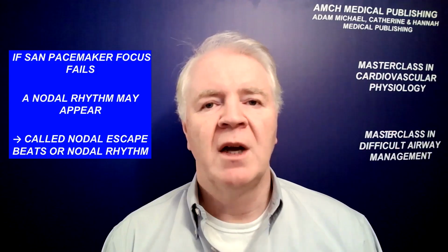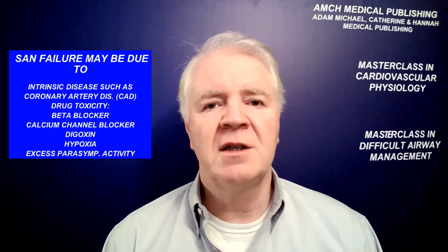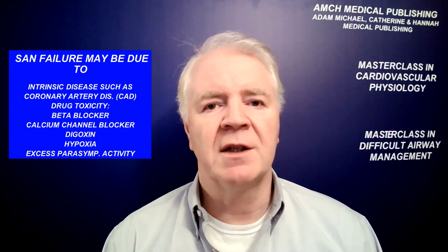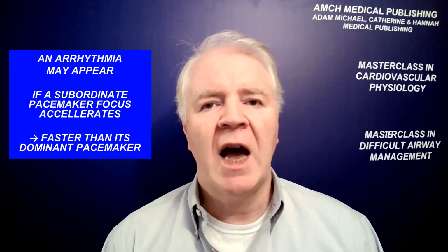This is nodal rhythm, and the causes of nodal rhythms are those of sinoatrial node failure, such as intrinsic disease, such as coronary artery disease, drug toxicity of beta blockers, calcium channel blockers, or even digoxin toxicity, hypoxia, or excessive parasympathetic activity. Alternatively, the causes may be an abnormality causing a subordinate focus to inappropriately accelerate, such as stimulation of the AV node or the ventricular Purkinje tissues. Once again, intrinsic AV nodal disease can cause this, coronary artery disease, drug effects, or excessive sympathetic activity acting on the AV node. These are all possible causes.